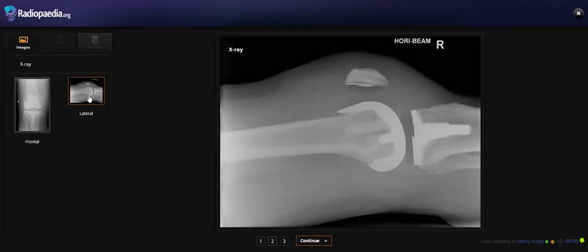Let's see the lateral view. In the lateral view, besides what we see on the AP, we can find gas and fluid level in the suprapatellar region where the joint effusion is visible.